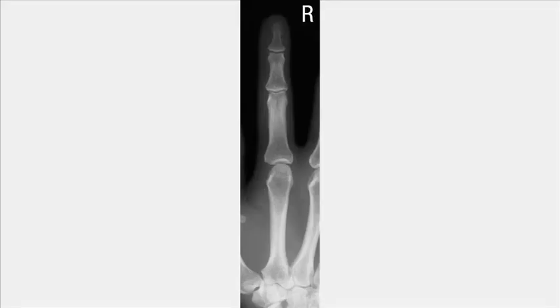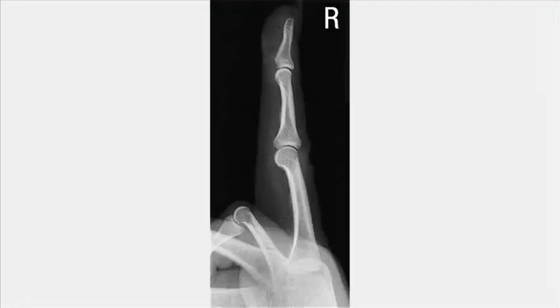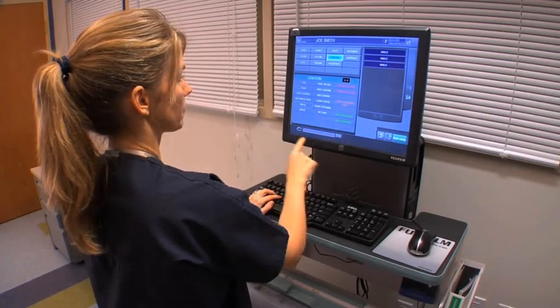Review the images for the three projections. To image any of the other fingers, use a similar technique.